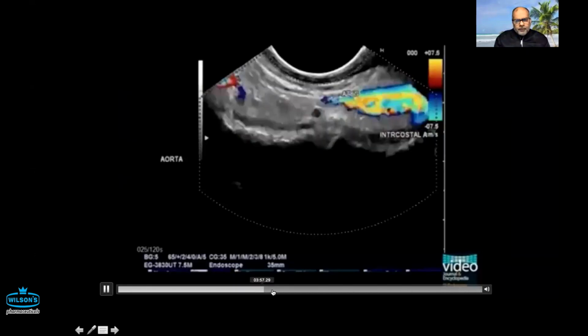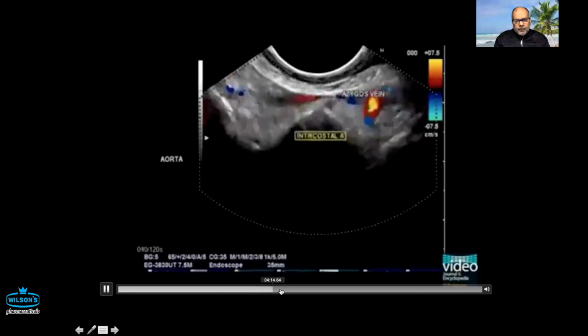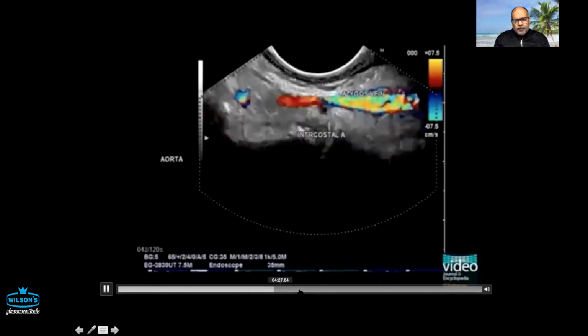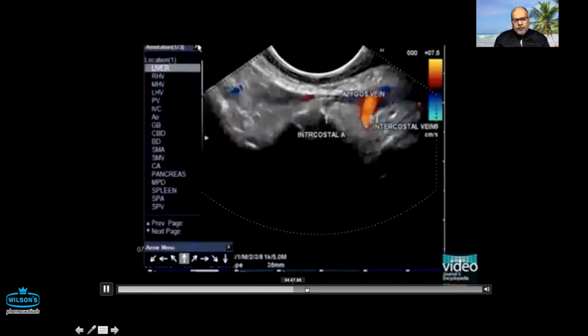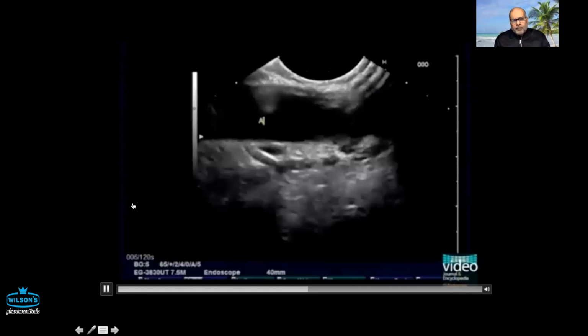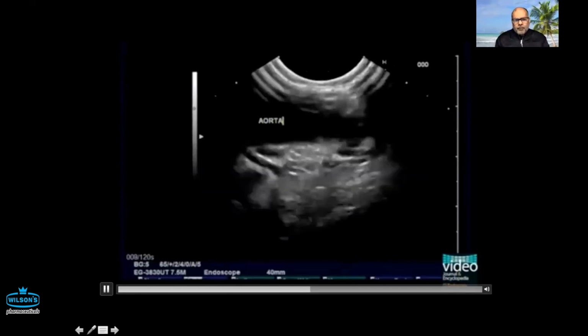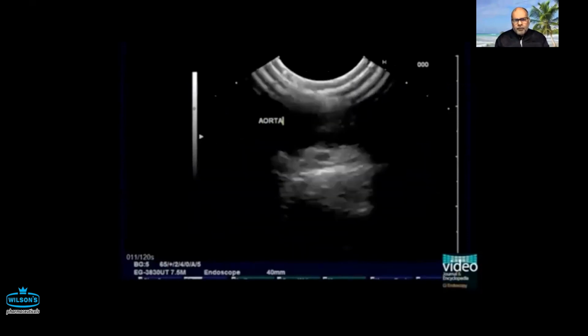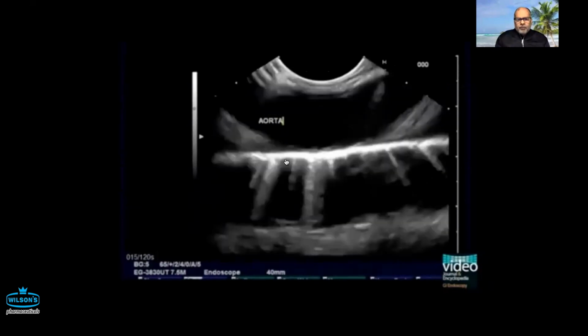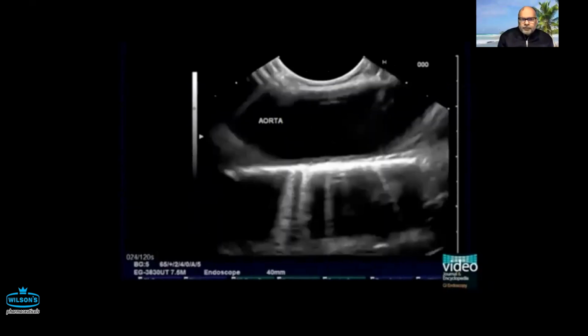Clockwise rotation in presence of numerous intercostal veins, to the esophagus. When the scope is pulled back slowly, the descending aorta is traced up as a large tubular structure which forms a bright, deep interface with the left lung. The interface with the left lung sometimes creates a mirror image of the descending aorta. The origin of the left subclavian artery from the upper border of the arch is also seen.